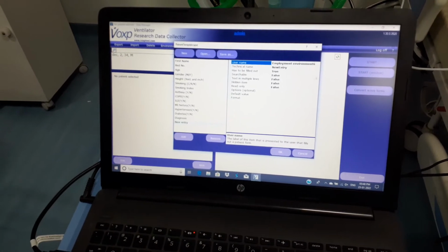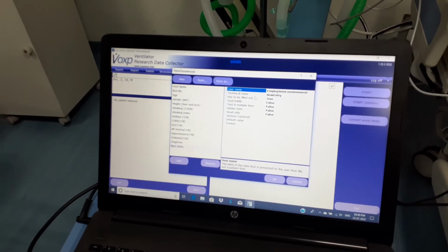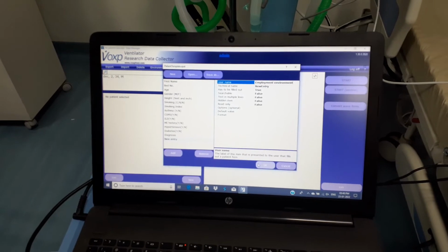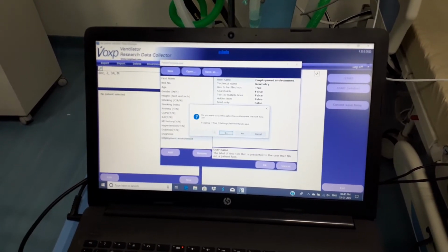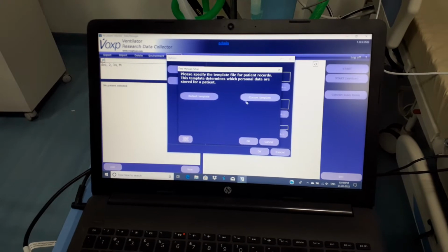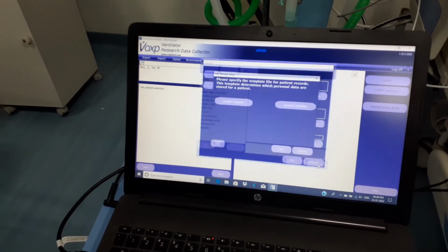Okay, so we can put it here, and we can change it so that it is compulsory, has to be filled, true, and other things we can make optional. In this way this can be stored. But okay, we do not want this, so I'm not saving it. Let me check whether it is saved or not. Customize template, no. Okay, it's good.